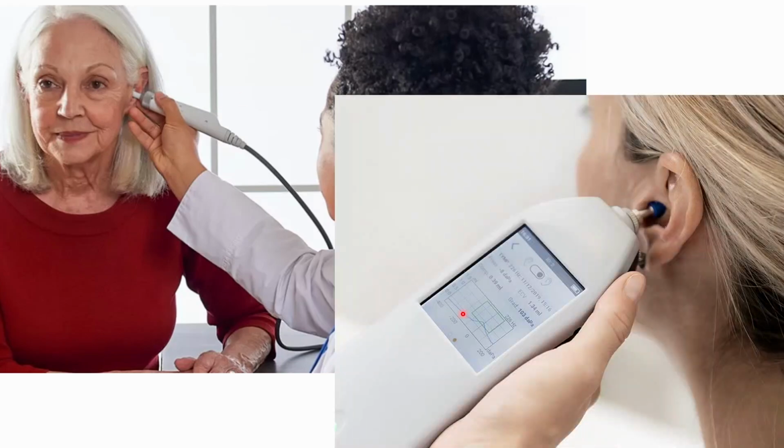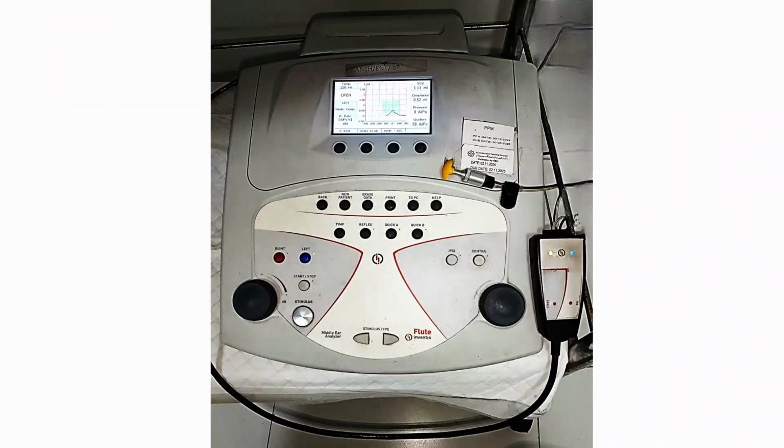Same for this handheld, you just have to place it inside. Sometimes we may have to pull the pinna upward, backward, and laterally, so the probe will snug in comfortably. So again, when you put this probe inside the ear canal and press the button, a graph will be plotted.